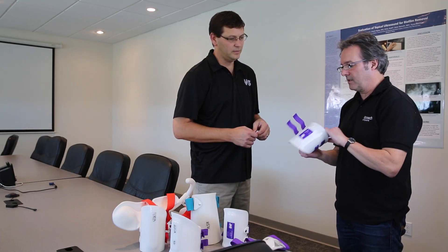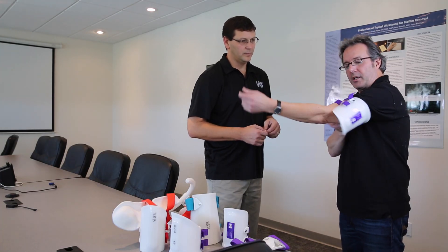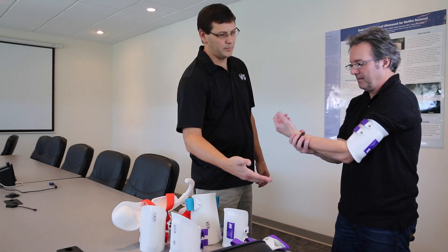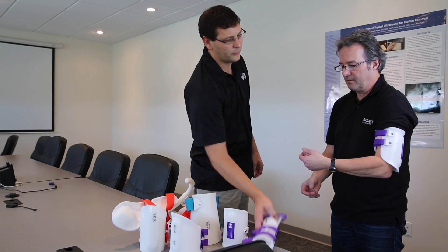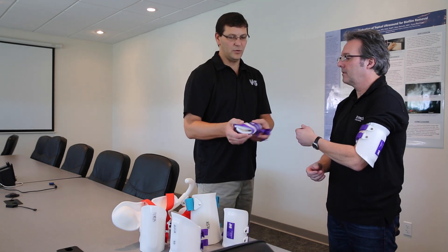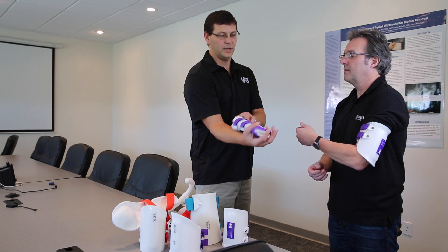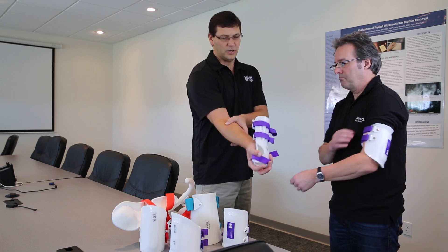This is a cuff device, so this would go on your arm like that. That would be attached to a pronation supination device frame, and this hand plate would actually go on your forearm and it would rotate your forearm in supination and pronation. So it would stretch your forearm muscles.